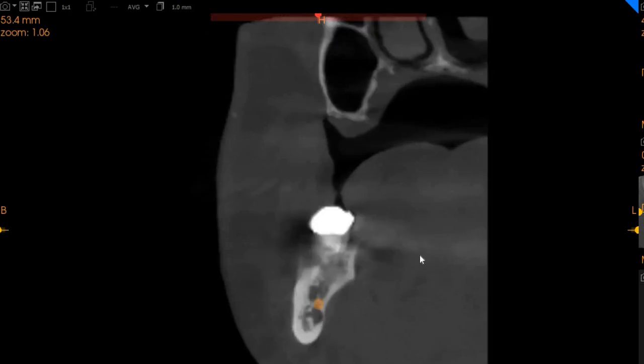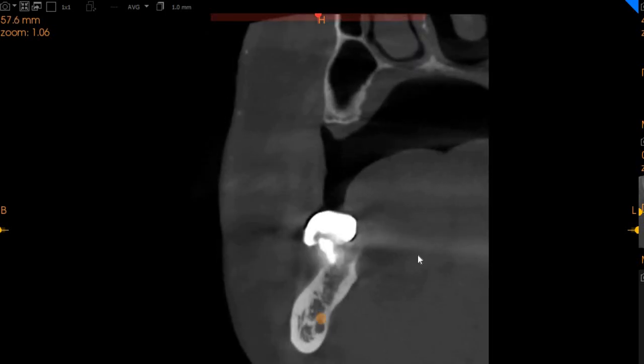This is the lower right seven, which is the distal part of the bridge. As you can see, there is significant bone loss around this tooth, so this bridge is definitely compromised. Thank you very much.